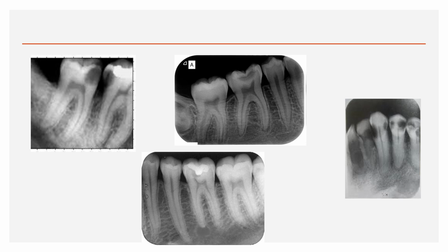So it can be really helpful for the diagnosis part. So that's why it is important, just before going for the diagnosis, you have to confirm with the investigations. Then the last one, that is the restoration with secondary caries. Here also it's really close to the pulp. So by taking an IOPA, we can see what the present condition of the tooth is.